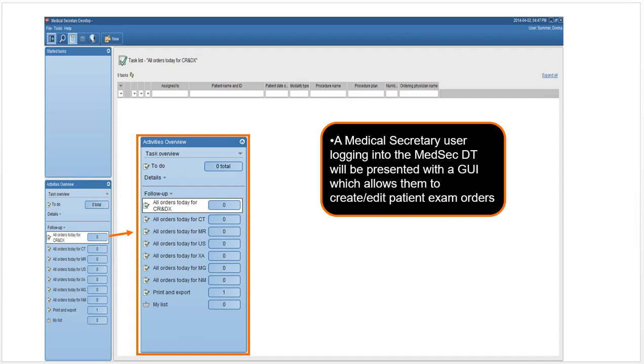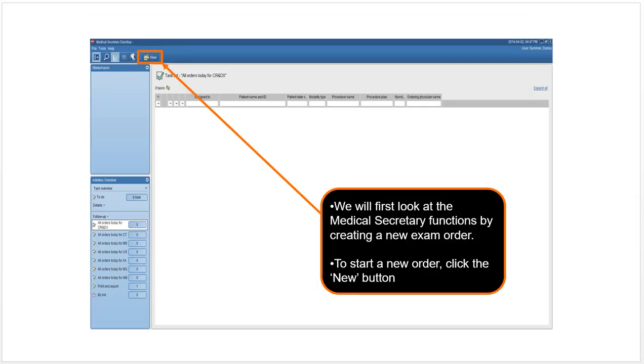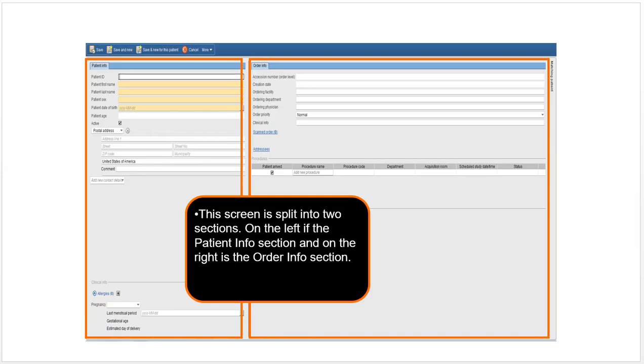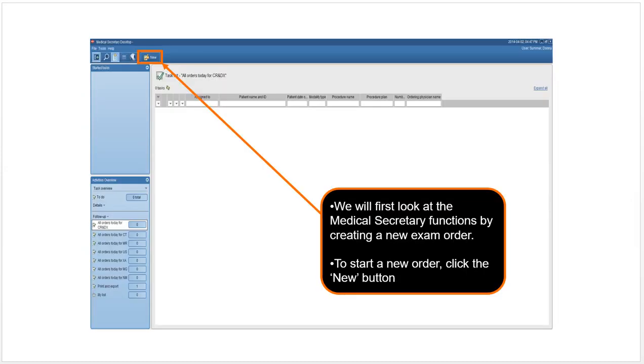If you need to start a new order or create a new patient, you always want to look for the new button. There's always a new button when you start a new task. These are for tasks that have been started by you or somebody else—they're in-progress tasks that need to be completed.